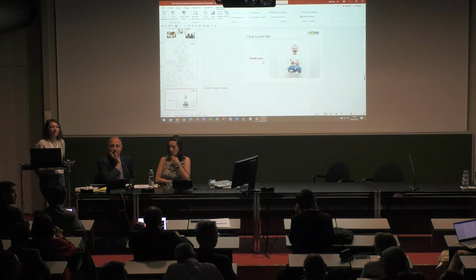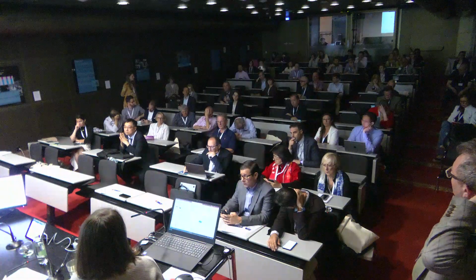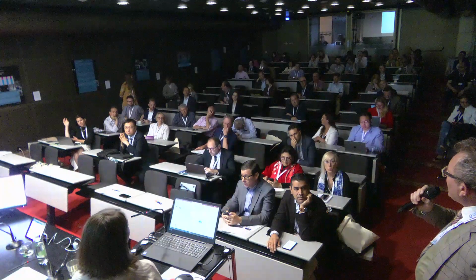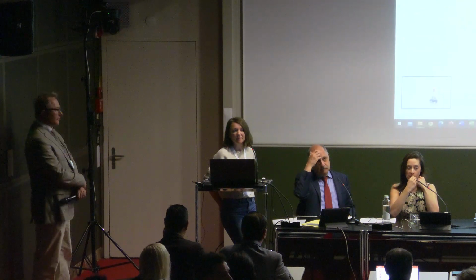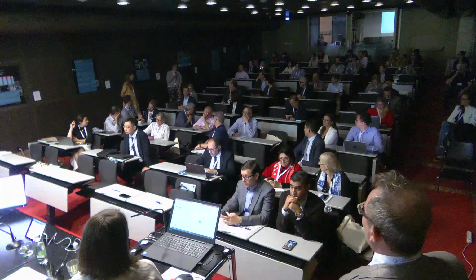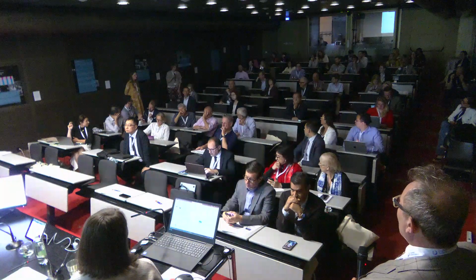Just a short technical question. What's the maximal balloon volume that you use in a child with megarectum before you say the reflex is absent? 100. I mean, it is age dependent. Isabella might know, there's a stepwise process that has been published by a London group. I don't think it was Great Ormond Street. It very much depends on the age. In an infant, you will never go to 100. It would depend on the radiologic finding of the megarectum. If you have a megarectum with a diameter of 10 centimeters, what happens?